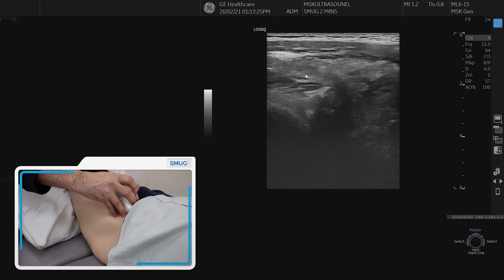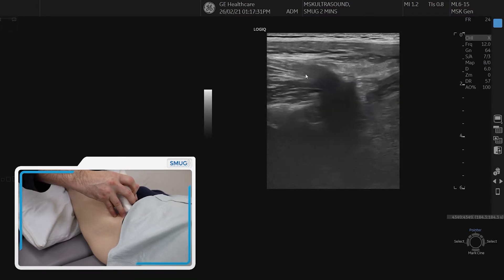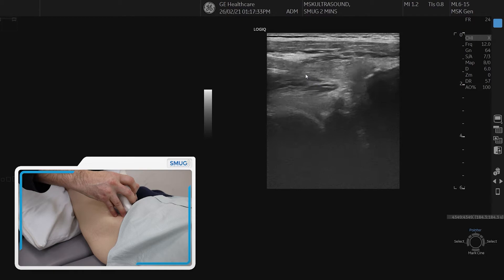The nice thing about this is we can also see the joint underneath it. If I optimize the joint a little bit, you can see the capsule, and then the acetabulum. So you get some information about the anterior joint at the same time.